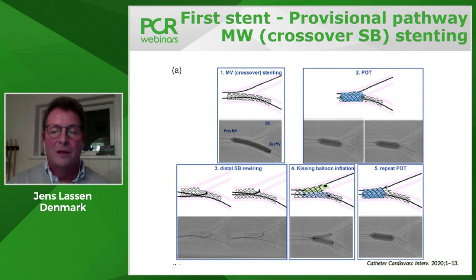So this is actually how to make that scaffold, which is a single stent technique, and most often this is sufficient to treat even a very complex bifurcation. But if not, next slide, please.